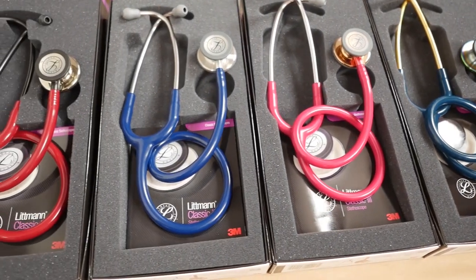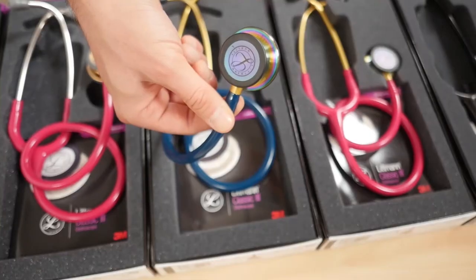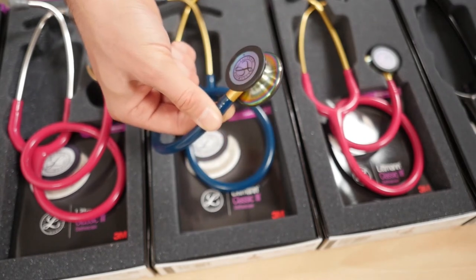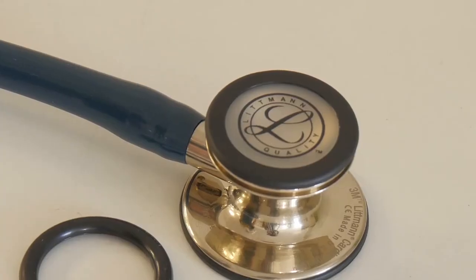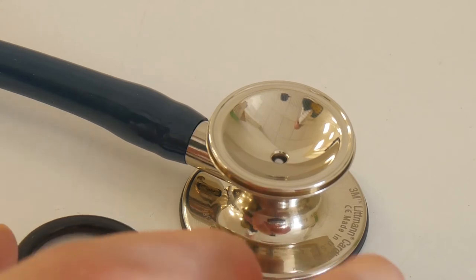Its double-sided chest piece with tunable diaphragms on both the adult and paediatric sides means you only need one stethoscope to practice listening on patients of many ages and sizes. The paediatric side also converts to a traditional open bell by replacing the single piece diaphragm with a supplied non-chill rim.